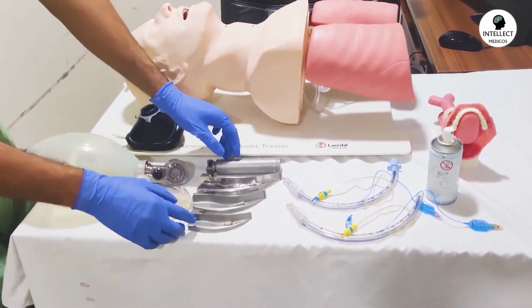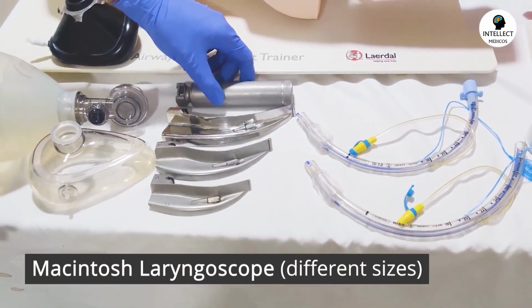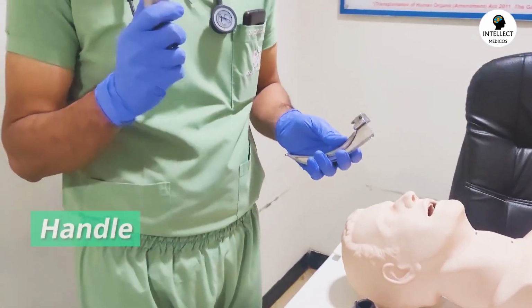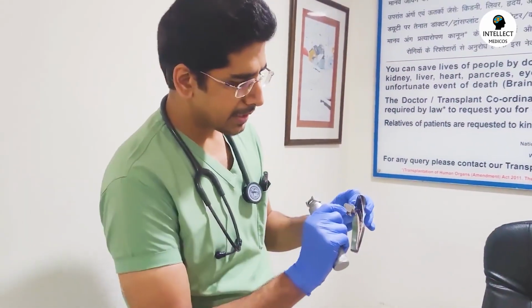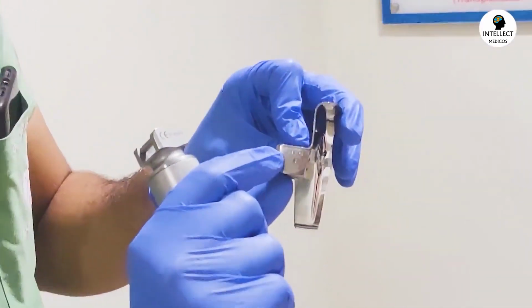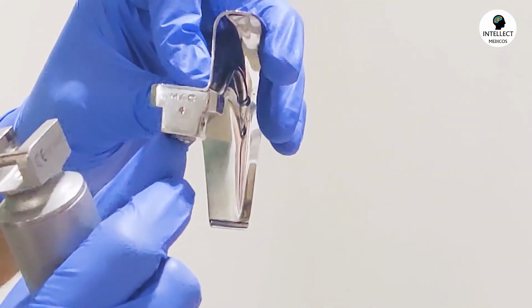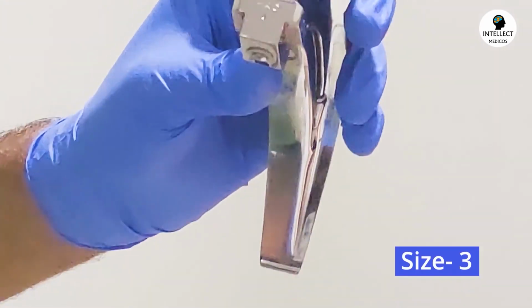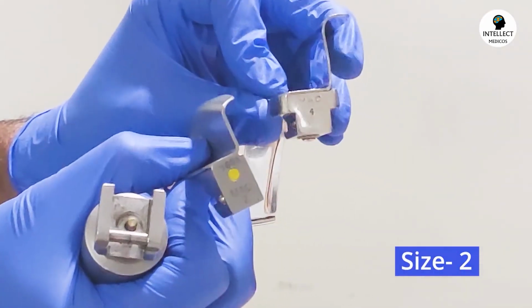Now coming on to the other equipment. These are different sizes of laryngoscope, mainly the Macintosh laryngoscope. Now I'll show you. This is the handle of a Macintosh and this is a blade. And you can see the sizes are written over here. Mac, size number 4. So there are different sizes. You can see the size number 3 and the other is size number 2. Can you see it?